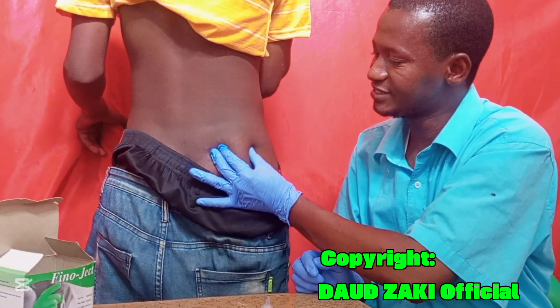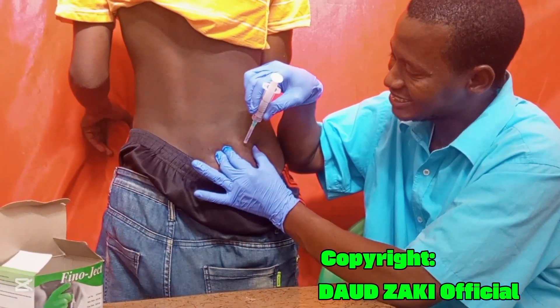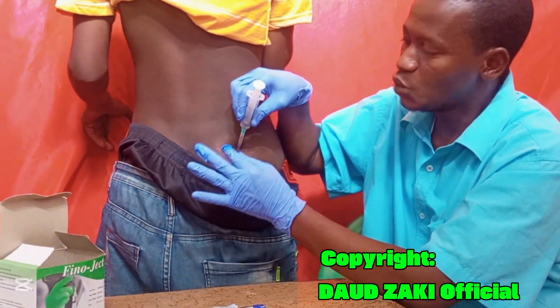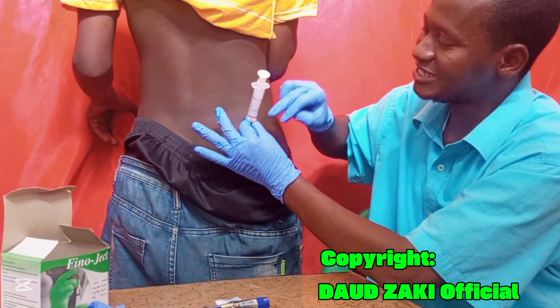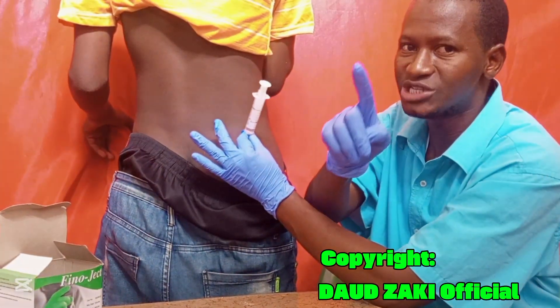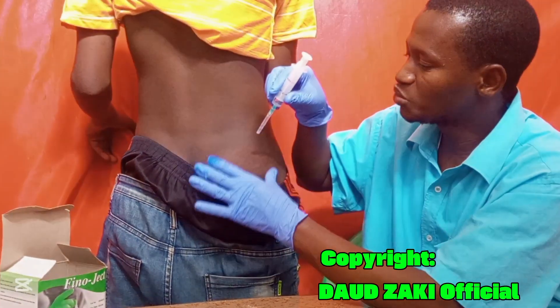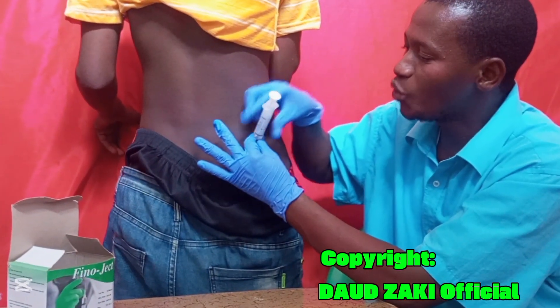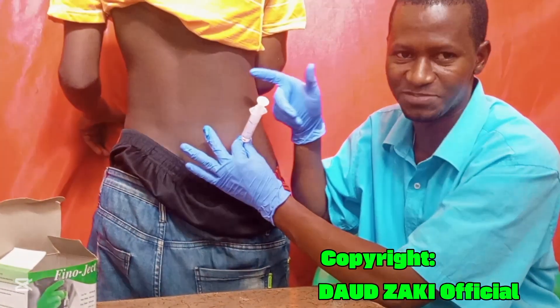Grab the skin, then insert the needle at a 90-degree angle deep into the muscle. Once inserted, release the skin and hold the barrel of the syringe. Aspirate first — pull back the plunger. If there is any blood flashback in the syringe, do not inject; remove the syringe and start a fresh injection. If there is no blood, you can safely administer the drug to the patient.